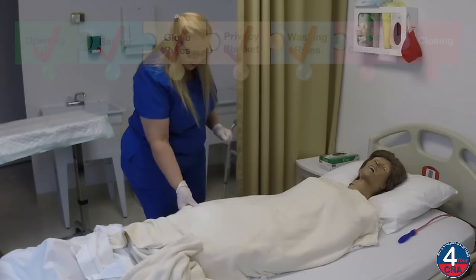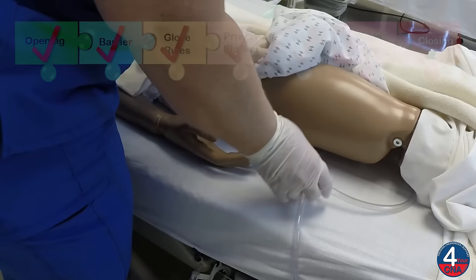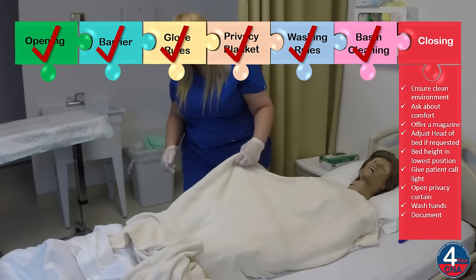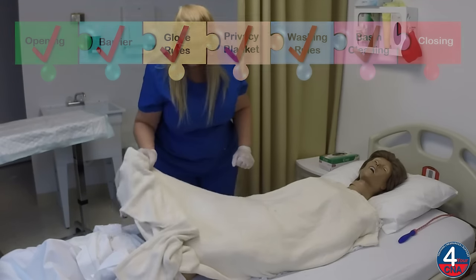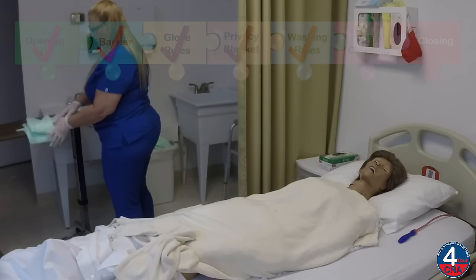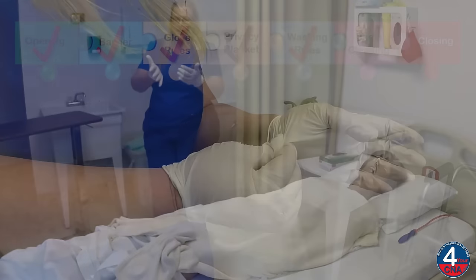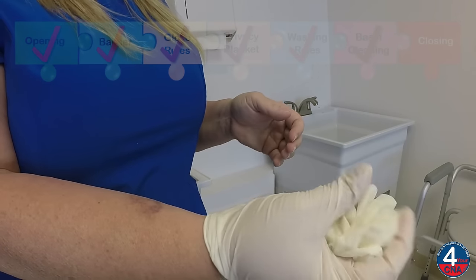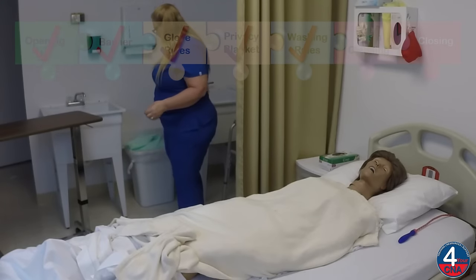Okay, Ms. Jones, let me just look at your catheter one last time. Make sure that the catheter tubing is coiled on the bed, that the catheter is not on the floor. Everything looks good. I'm going to remove the chucks from the table and throw this away. And then I'll remove my gloves. We'll throw those away.